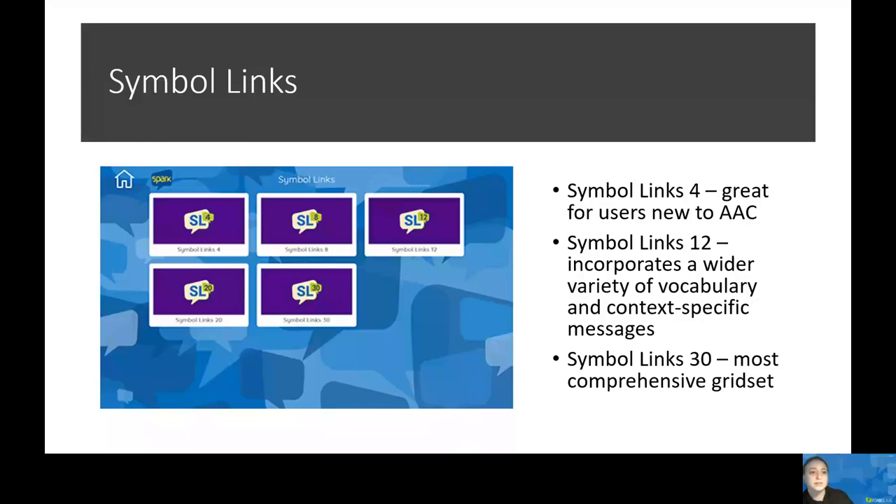Next, we have Symbol Links. This is available in 4, 8, 12, 20, and 30 button grid sets. This is a great symbol-based communication system that provides support for those who are not yet literate, designed to enable users to find words quickly and easily. Symbol Links 4 is great for emergent communicators, featuring four cells per page providing rapid message selection for basic communication needs such as a person's name or personal information, quick phrases, and requests for help.